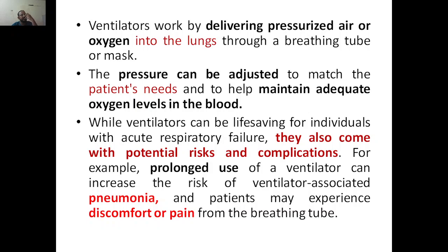Like this, the nose and mouth will be covered, and with the help of that it will deliver the pressurized air. It will pressurize the air and force the air to enter into the lungs, so that the oxygen is delivered adequately. That means the amount that is required. Next, the pressure can be adjusted to match the patient's needs.